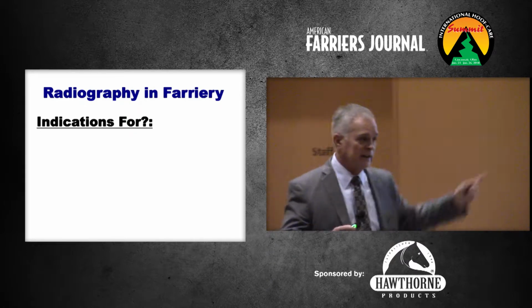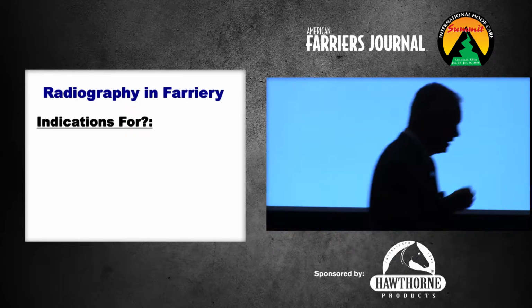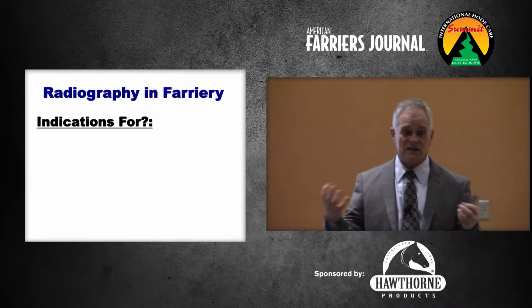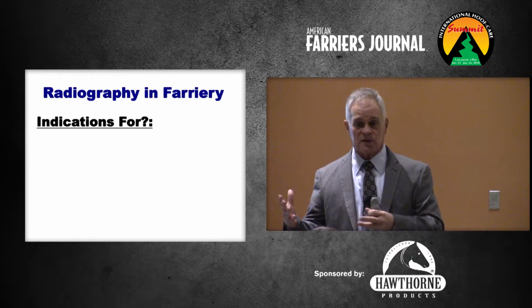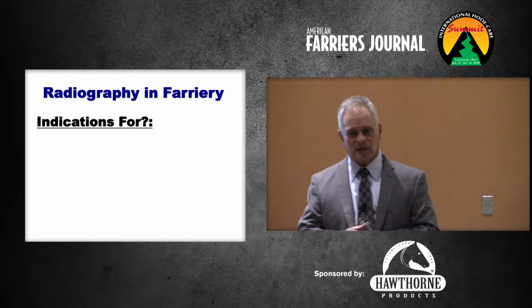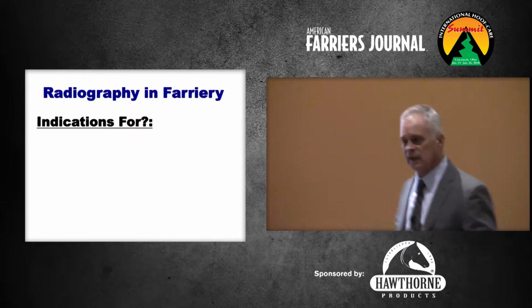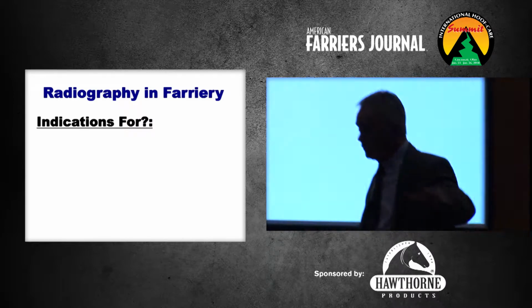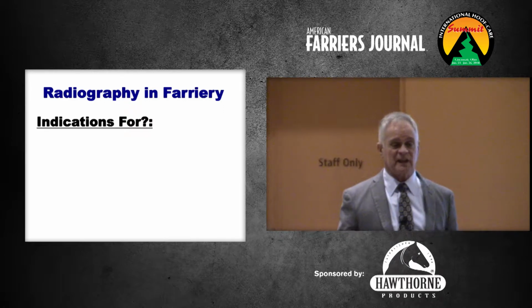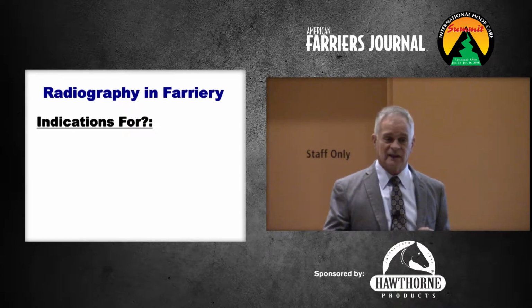Okay, so very helpful. Any others? Okay, so center of rotation, sole depth, and a lot of parameters that may just help improve shoeing of an individual horse. Where we use that is specifically in the lame horse, because we're always trying to fix something, do something a little bit better. So using the radiographs to help our farriers is very important. Sole depth would be one of those parameters that would be really important to us in a lot of different cases. You guys do a great job of judging that in your everyday life, but in some of the more difficult cases, it can get away from you or be hard.